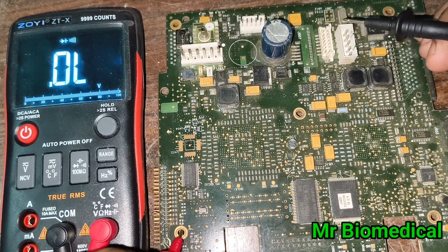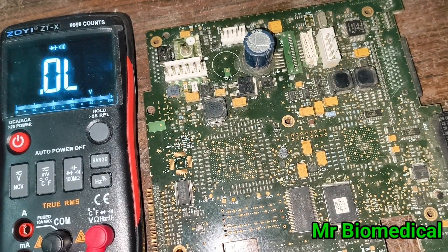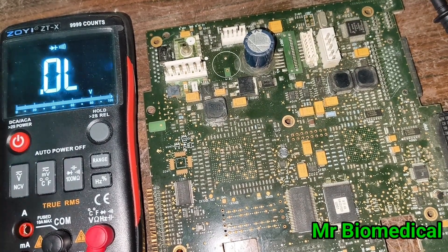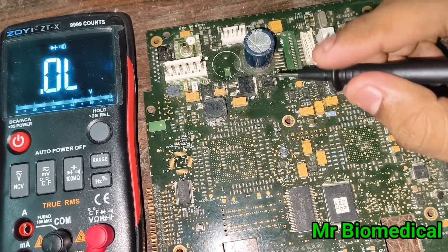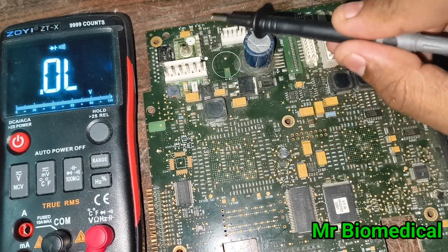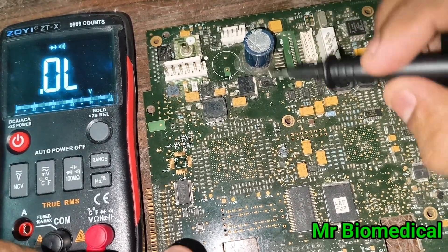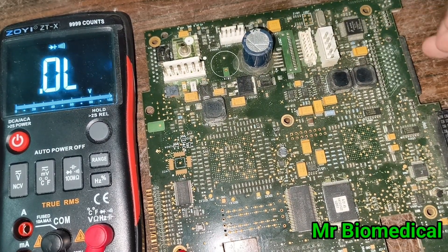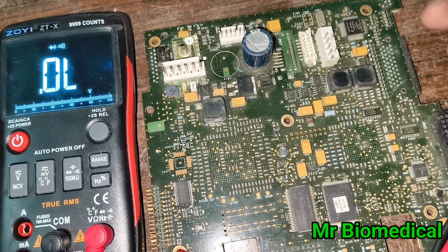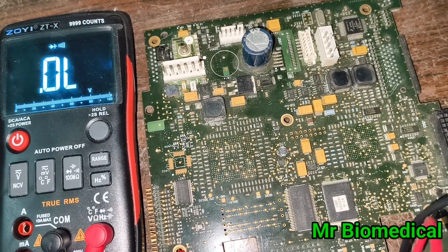The concept is that every single component's negative point will be connected to the ground. In some cases there will be no common pins for the negative lines — there will be a separation. This board has a common negative side so we can check it easily. Maybe in a future video I will share a board that doesn't have any common ground.